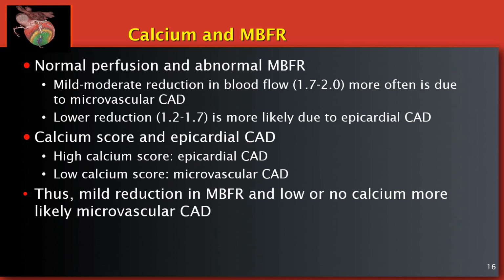So don't look at the actual calcium score when it's attenuation correction CT, but you can still evaluate those images for the presence of calcium, and it's still going to correlate very similarly. Mild reduction in myocardial blood flow reserve and low or no calcium more likely is the result of microvascular disease.